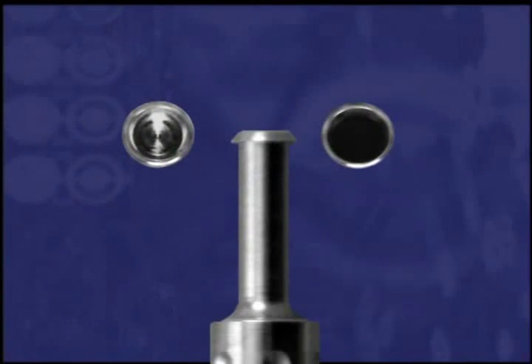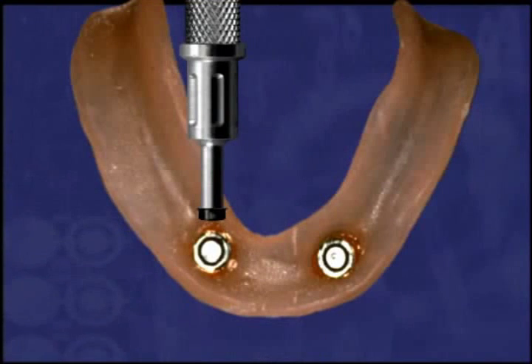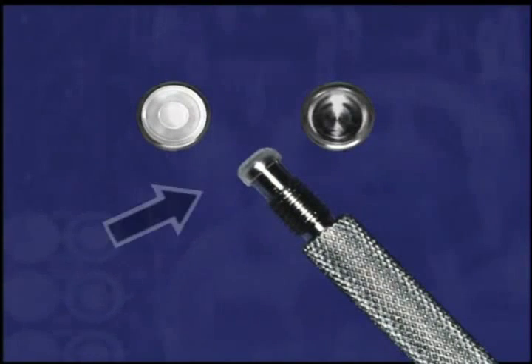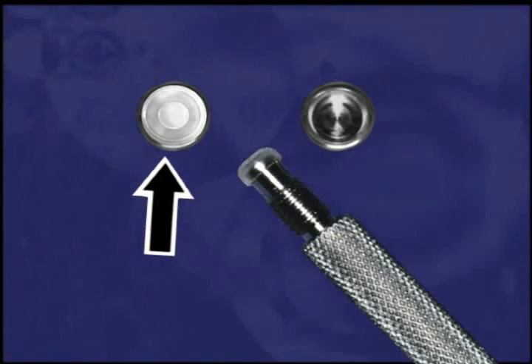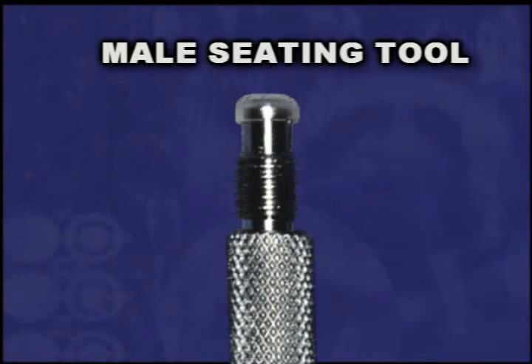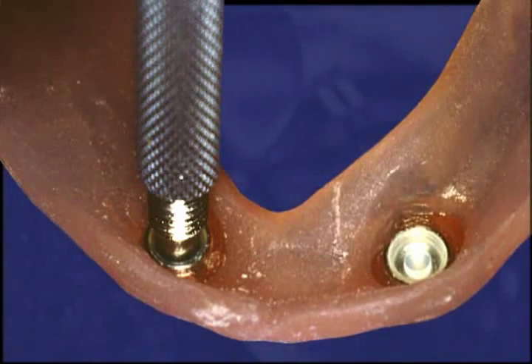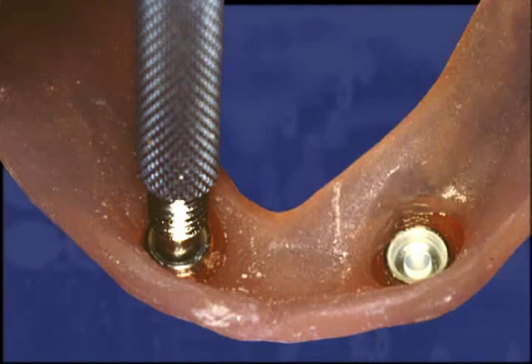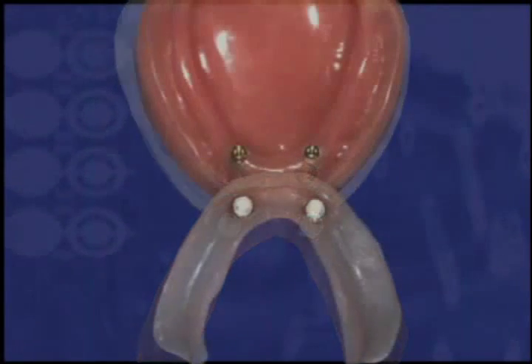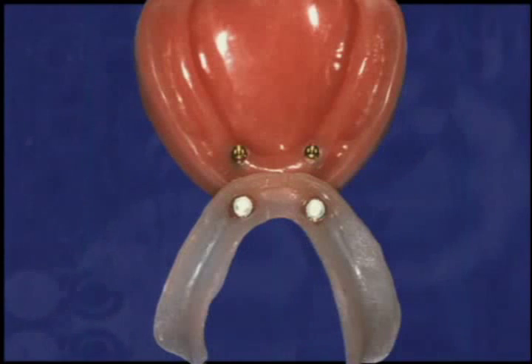Use the male removal tool to remove the black processing male from the metal denture cap. The male removal tool is pressed into the black plastic material to pull it out of the metal housing. The nylon locator replacement male replaces the black processing male for the final seating of the overdenture. The male seating tool is used to place the nylon replacement male into the empty metal denture cap. The replacement male should seat securely into place, level with the rim of the cap. Check the fit of the attachment-retained overdenture on the master cast before delivering it to the dental office. The indirect processing by the dental laboratory produces the same accurate result as a direct chair-side pickup.